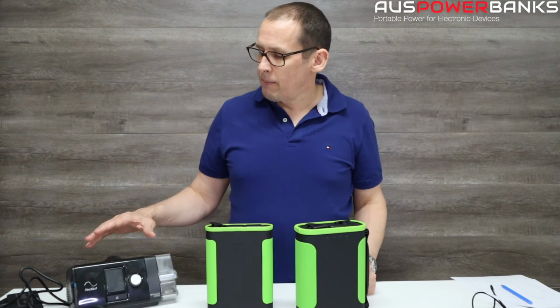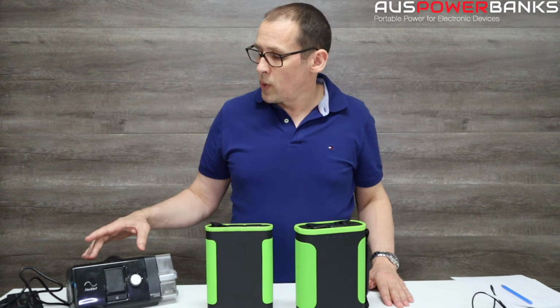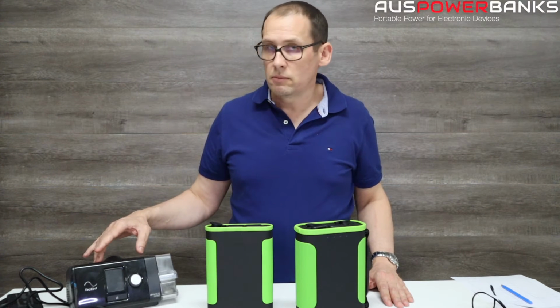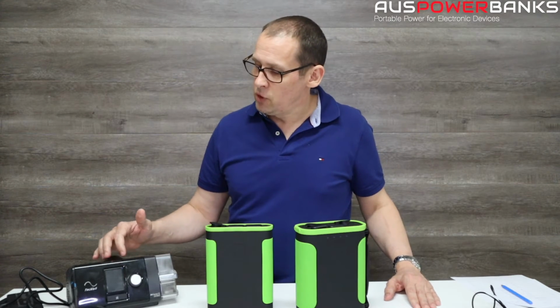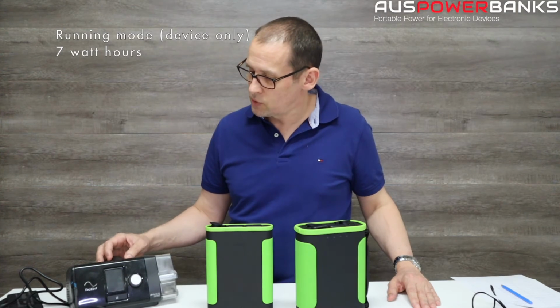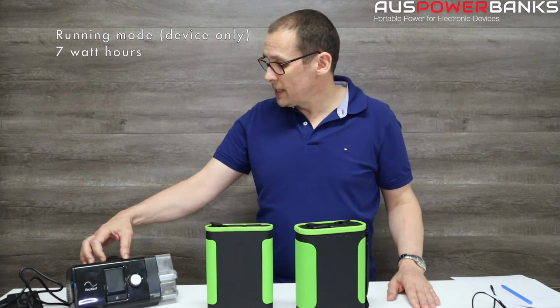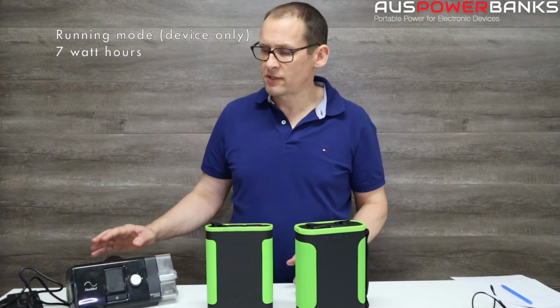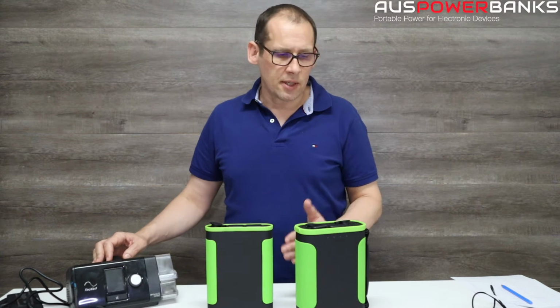And again, for example's sake, I'm going to take the ResMed. Now, you can use this in a few different ways. This has varied power consumption on it. So for example, if you were just using the pump part of it, the consumption per hour would be 7 watt hours. That's what it uses, and that's quite important to try and figure out what your runtime is going to be based on the size of the battery.